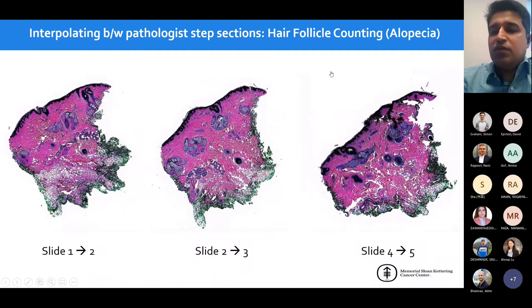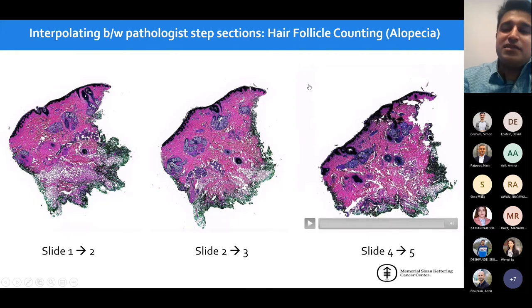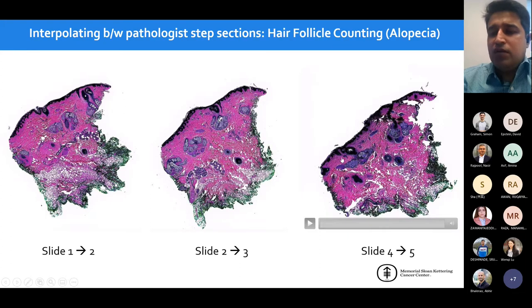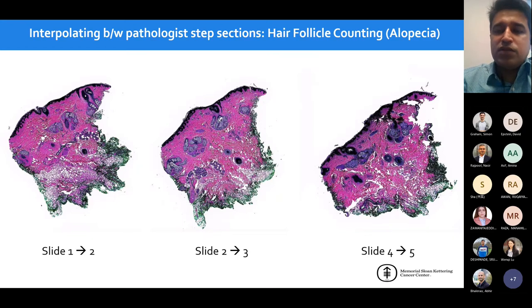And we are hoping that, using this framework plus some other frameworks that we have worked on previously, something called Ricci flow, we'd be able to constrain vectorial OMT with certain landmarks that the user can provide and speed up the process there too. And we are already also formulating this as a neural ODE, which allows us to speed things up and scale it up to whole slide images too.